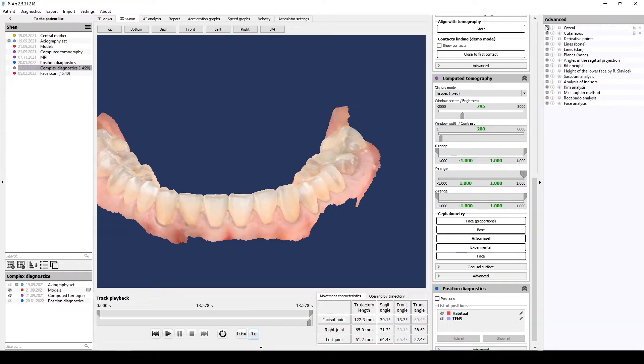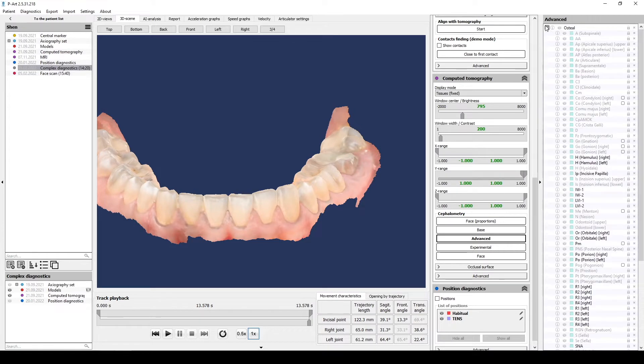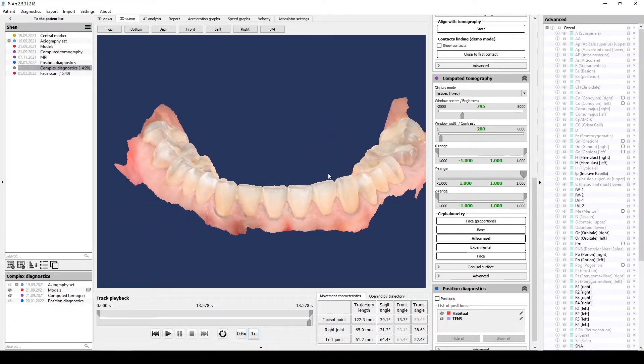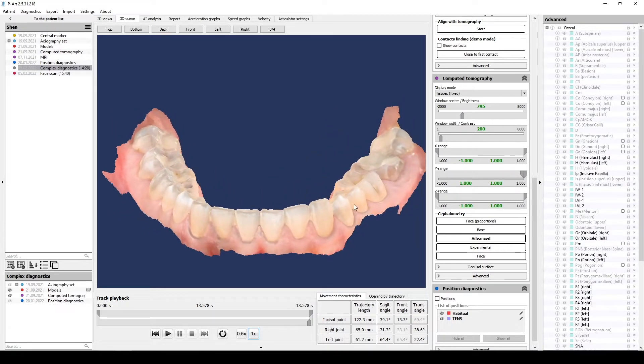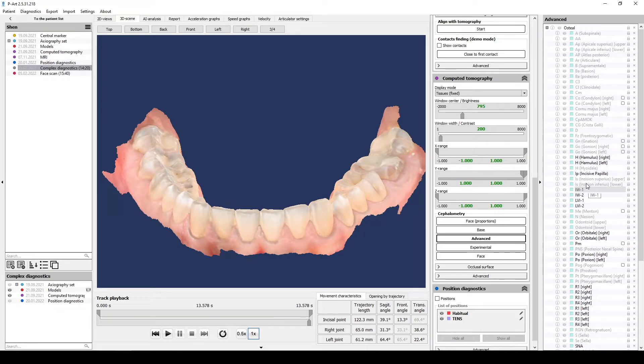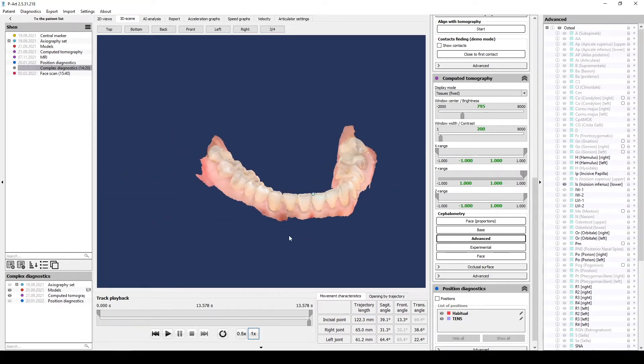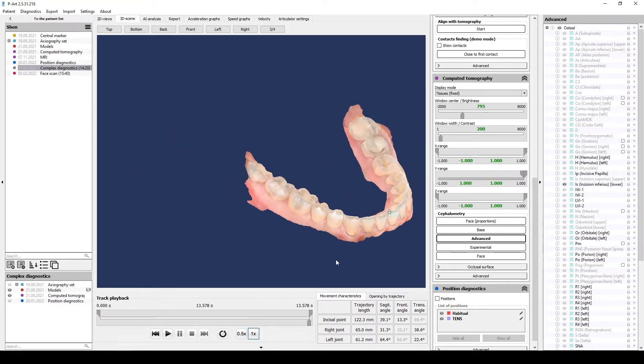In advanced cephalometry of tomography section we find bone points. We need incisal point of the lower jaw, incision-inferius. Place it on the cutting edge of the incisor, it will be the first point.